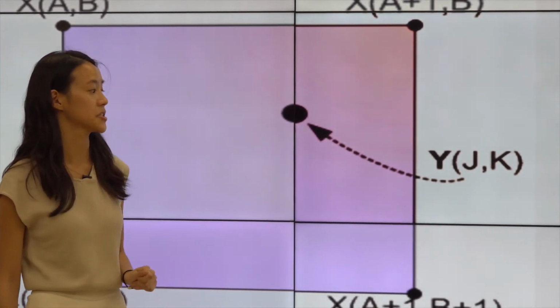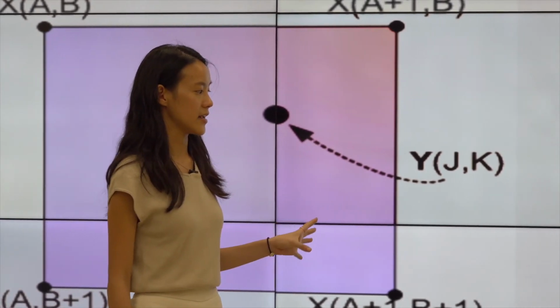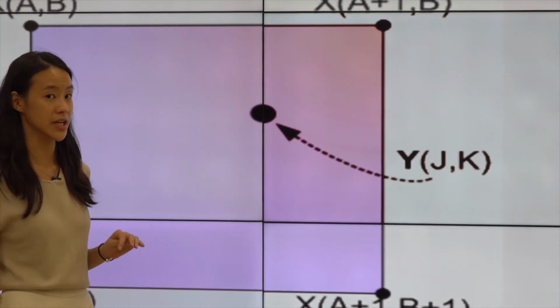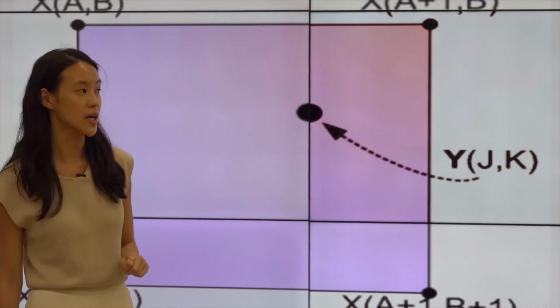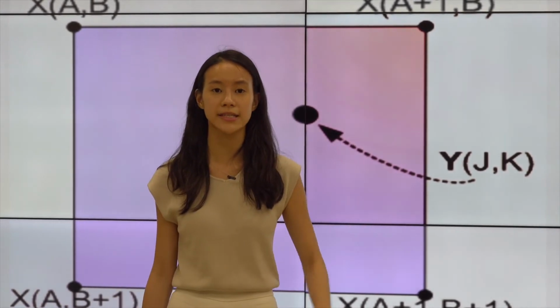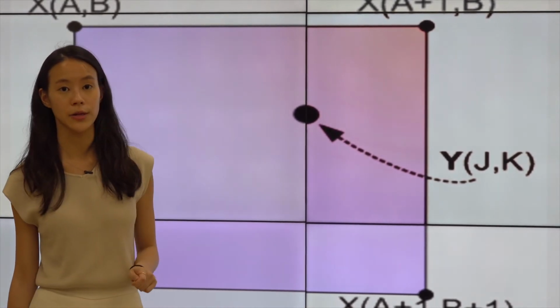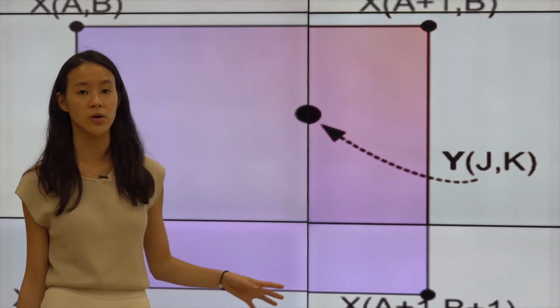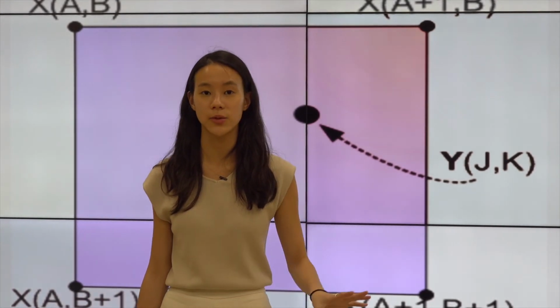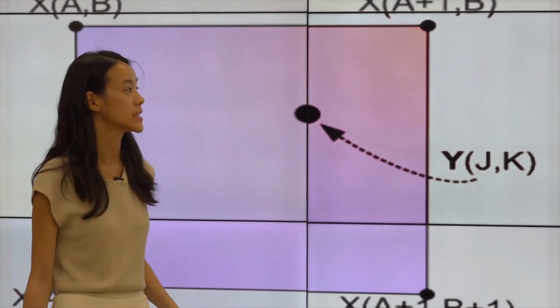The disadvantage is that it ends up with a pixelated image, and it is very blocky when you're using it on continuous data, as we will see later in a visualization. This makes sense because we're not considering any other parts of the room except for the closest corner. That's why we end up with a lot of pixelated images. There's no consideration of any gray numbers or any numbers between 0 and 1. It's either 0 or 1, no decimal point.